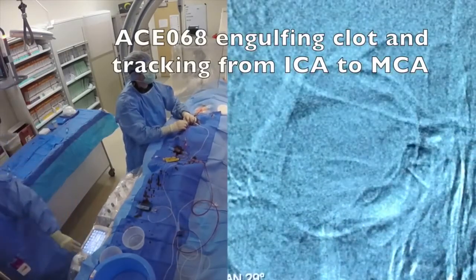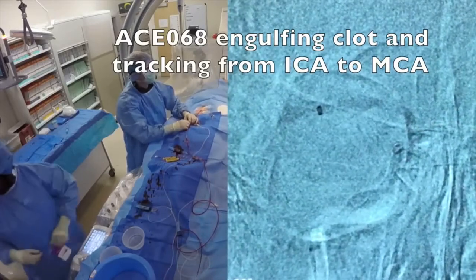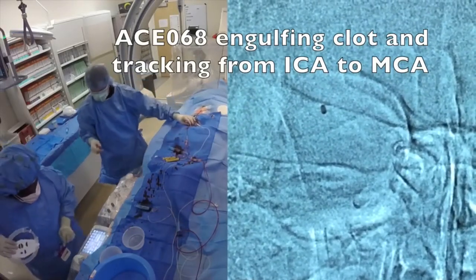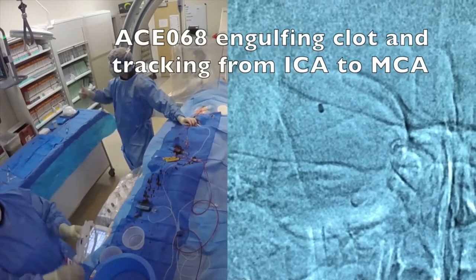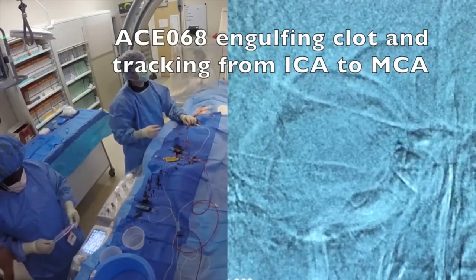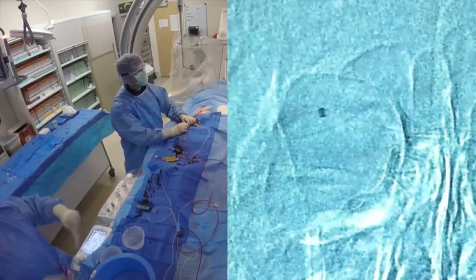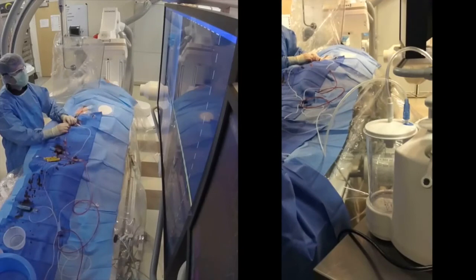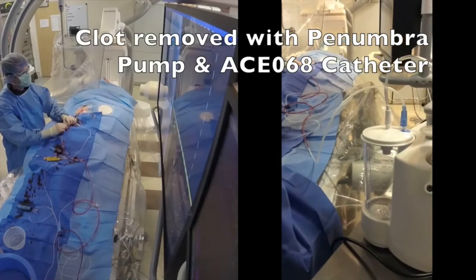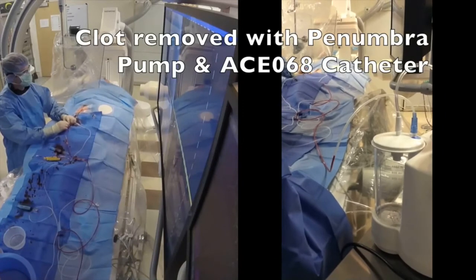As we're sucking the clot, we're also advancing the catheter higher into the internal carotid artery — it's actually gone into one of the branches, the right middle cerebral artery. This ended up being very beneficial, as the catheter was essentially able to engulf the clot while still aspirating and advancing, which wasn't always possible before. On the right-hand side of the screen you can see we're slowly bringing blood back and aspirating — sucking the clot out that was blocking that carotid artery.